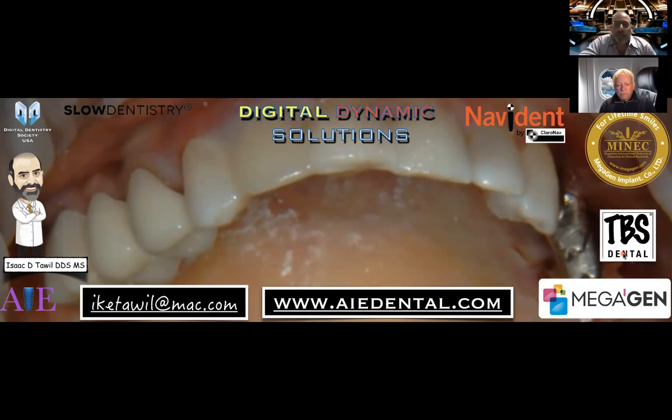Wow, that's actually a great question. I think that's where it becomes the most complicated cases that we have, these curved roots, because you have no idea where we are in the jaw. If we have a severely curved root and we're trying to access the apex of that root, how are we going to find the apex of that root?